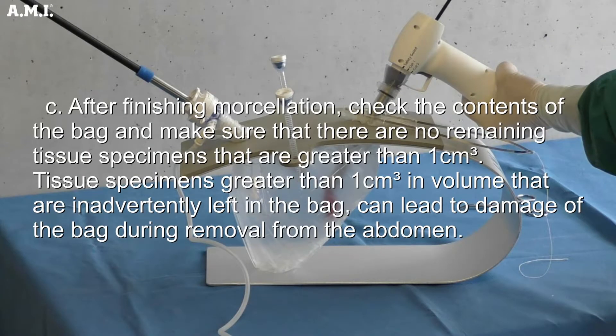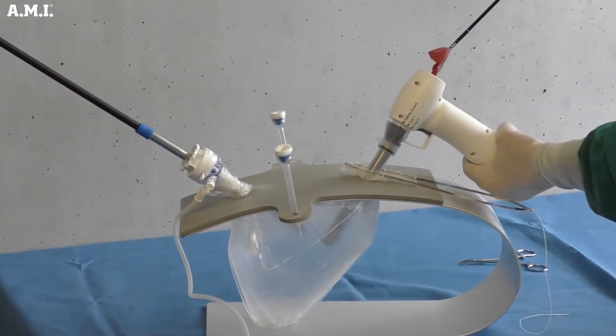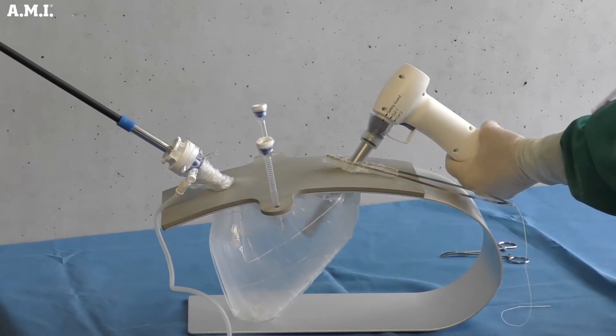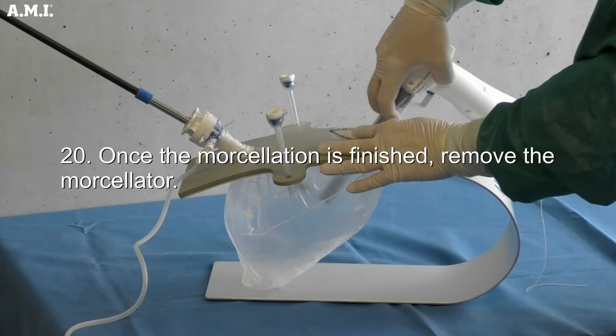Morcellate and remove the specimen out of the morsel bag. It is important to protect the morsel bag against mechanical damage by the morcellator and/or grasping forceps. After finishing morcellation, check the contents of the bag and make sure there are no remaining tissue specimens greater than one centimeter cubed in volume — specimens of that size inadvertently left in the bag can lead to damage during removal from the abdomen. Once morcellation is finished, remove the morcellator.